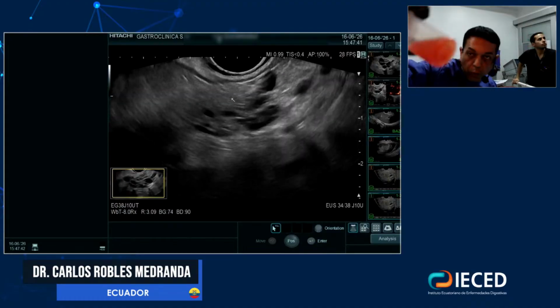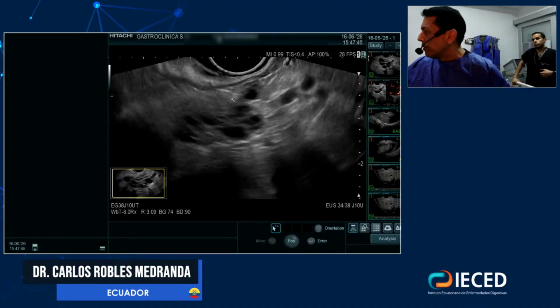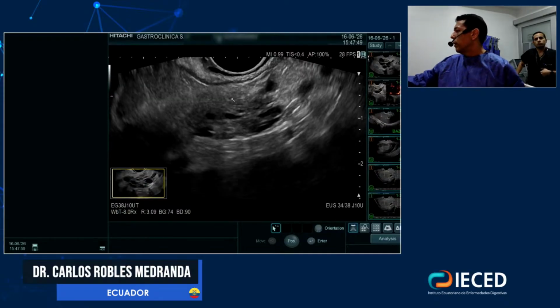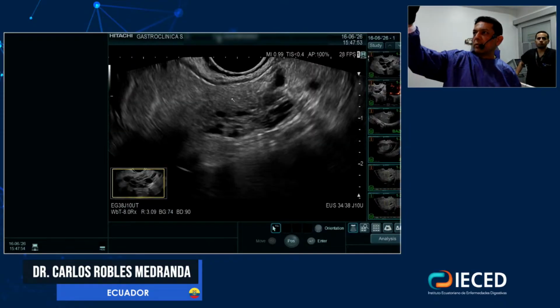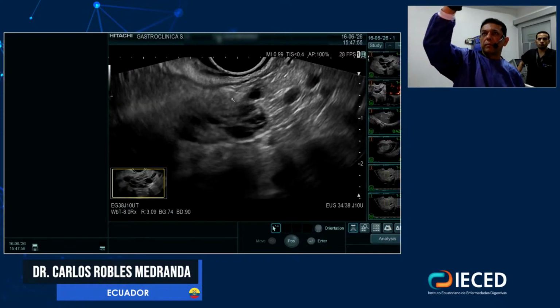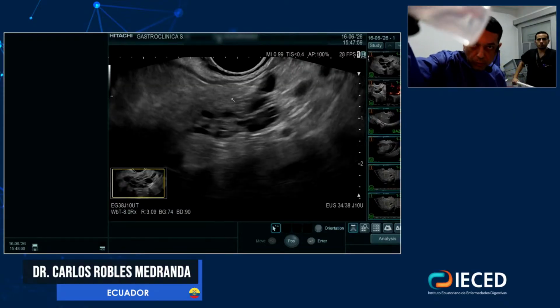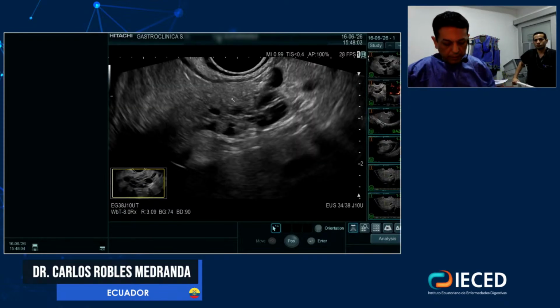This is what we have. Very good core here. And I want to see the small biopsies, but that will be more difficult. Let me see. The one from the Murray. We are finished. It's really small. It's just two small biopsies there, very teeny.